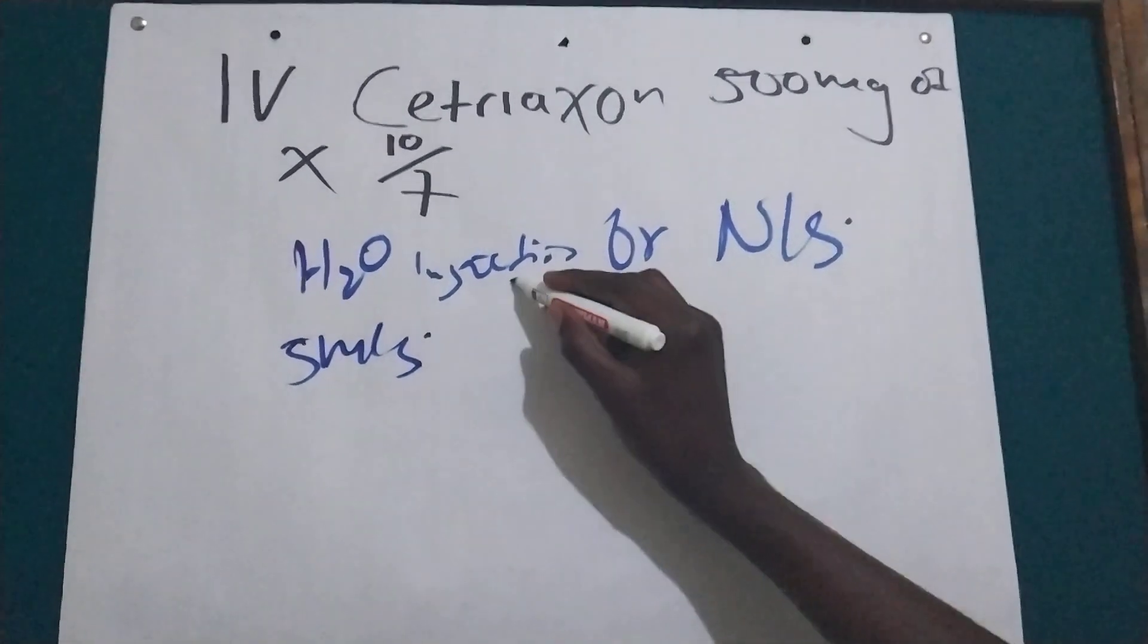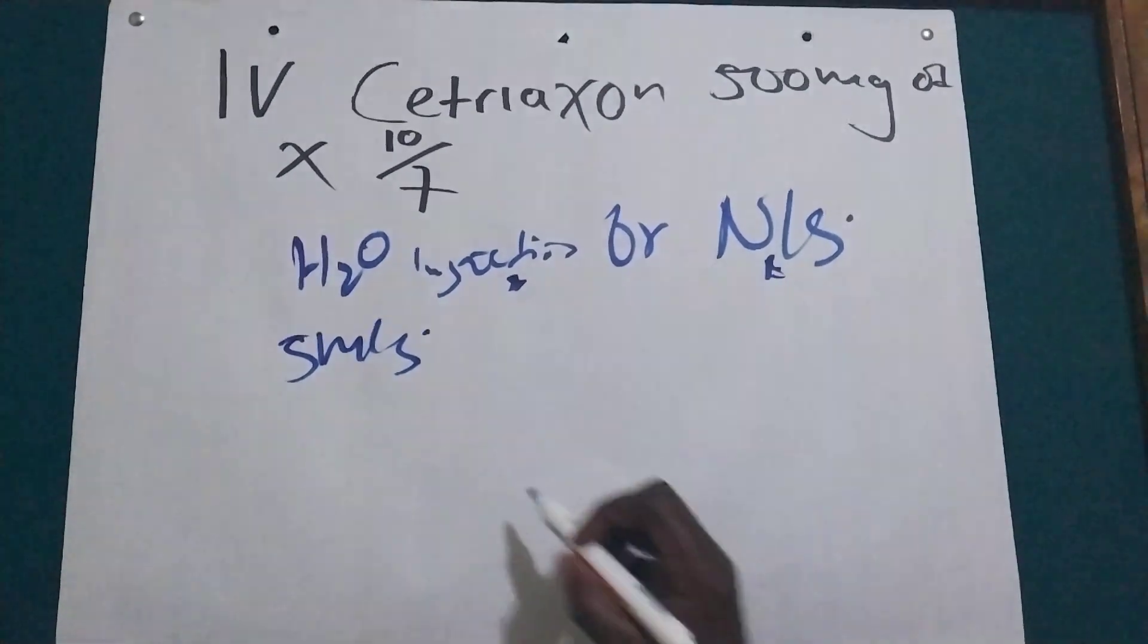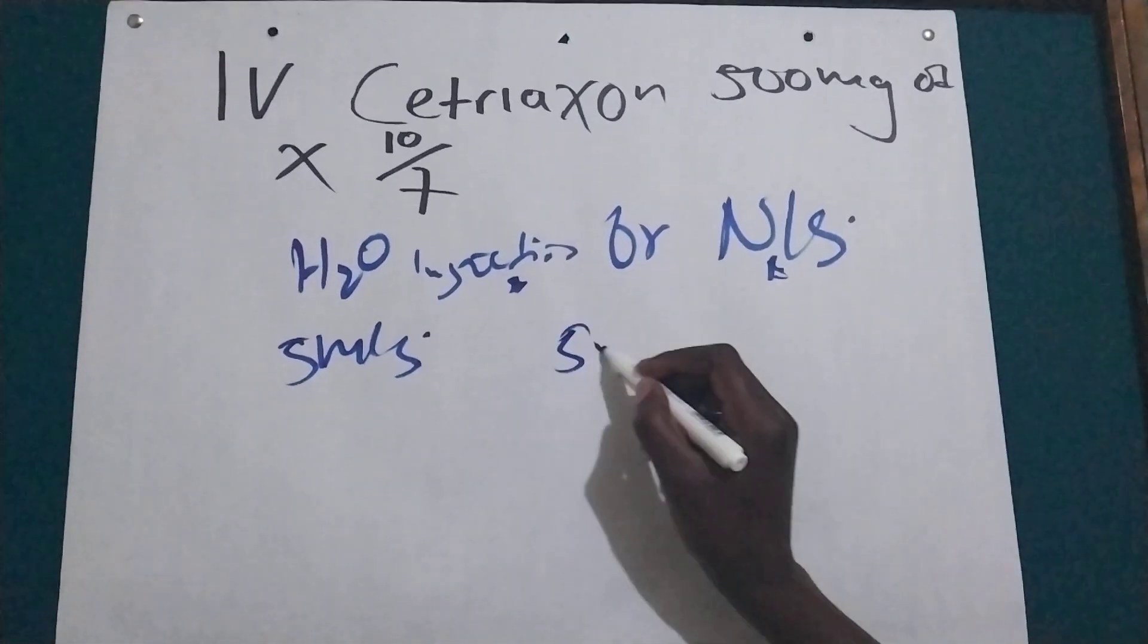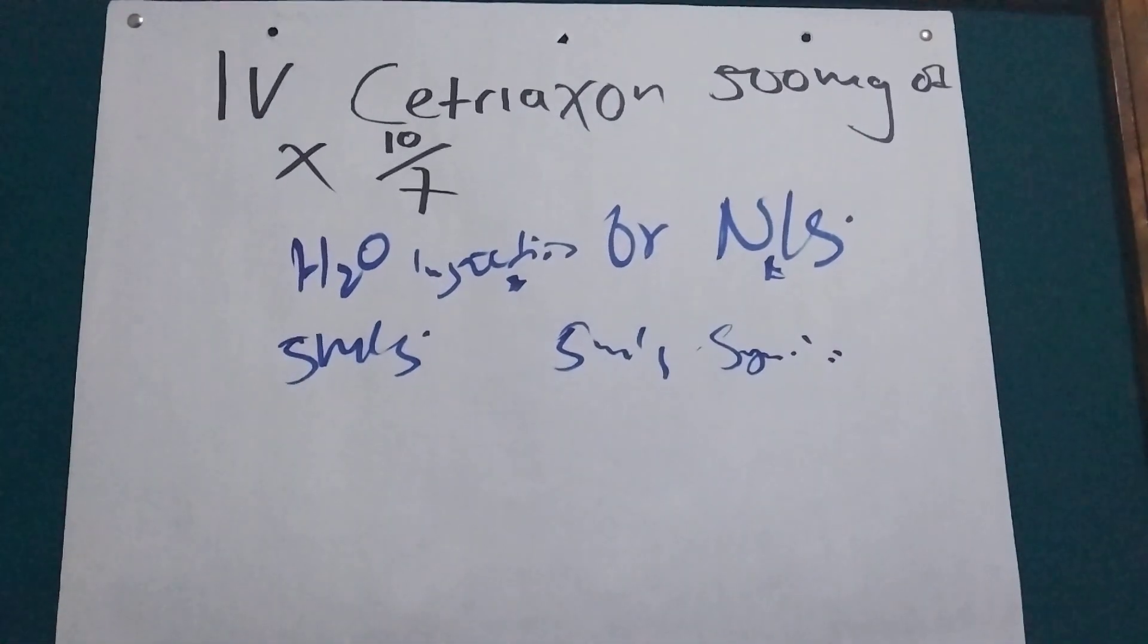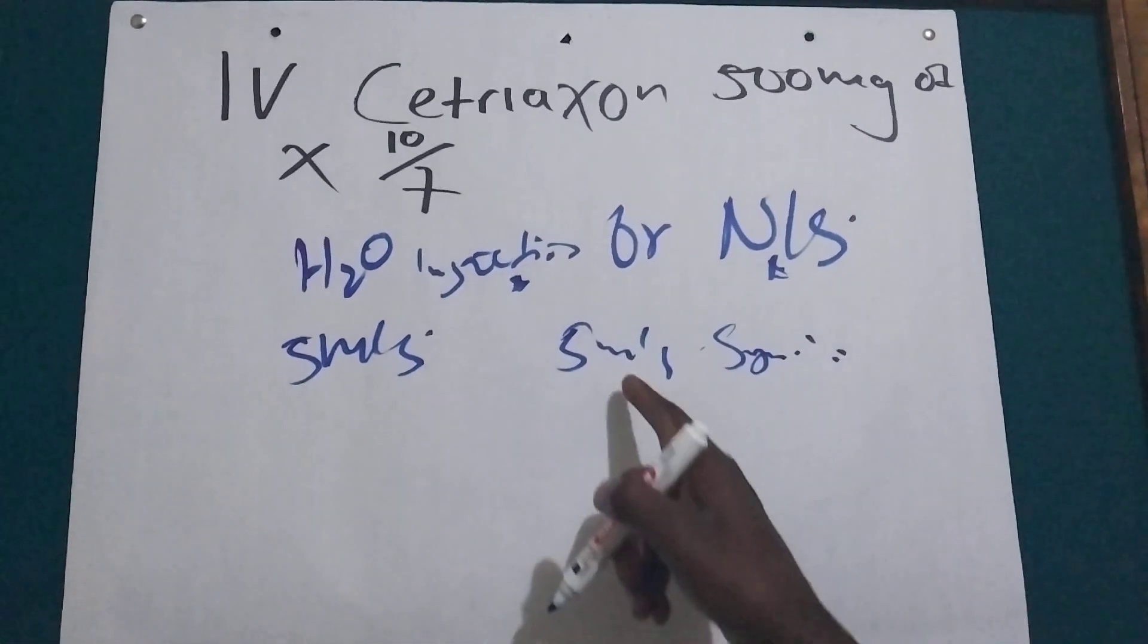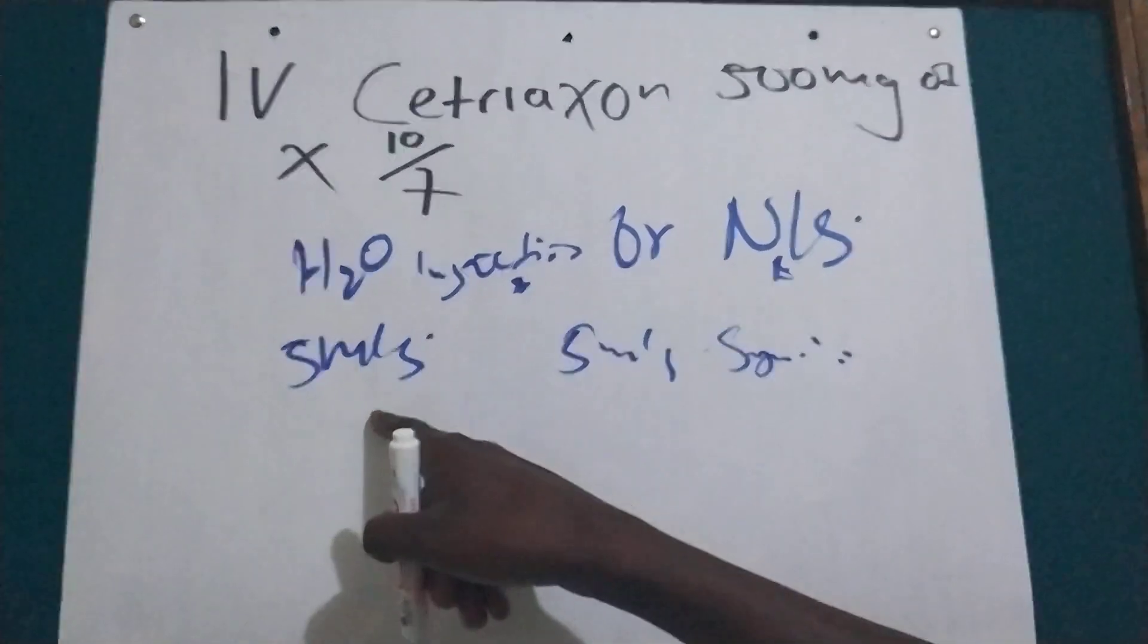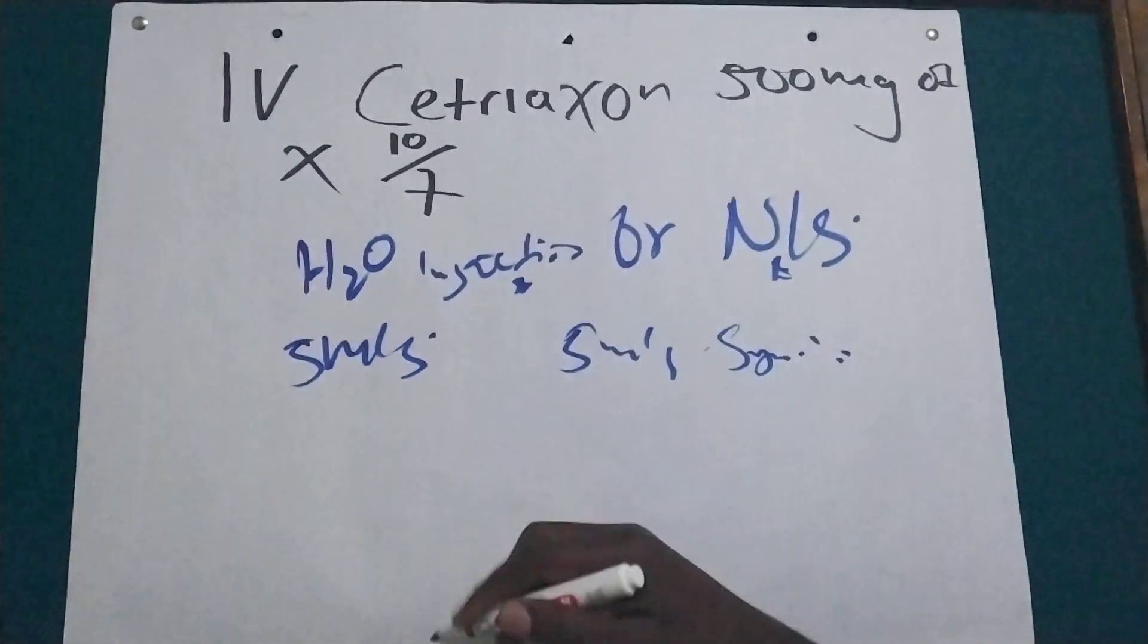Five mils of water for injection or normal saline and we are going to use five mil syringe to dilute this drug. So you just aspirate five mils of normal saline or water for injection.